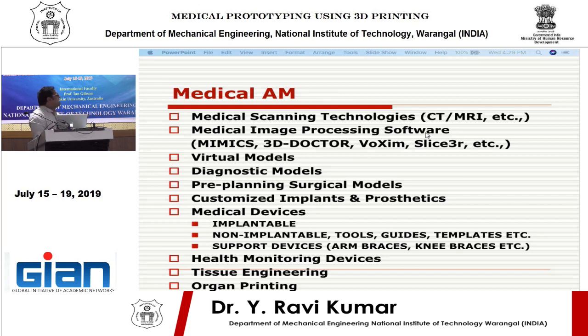It is not the standard size and shape of implants. Normally, whether an orthopedic, oral maxillofacial, craniofacial or any surgeon, they may use some standard sizes and try to fit them. But it never fits perfectly, right? And sometimes they may use the fibula bone. It may not be a 100% fitment, definitely.